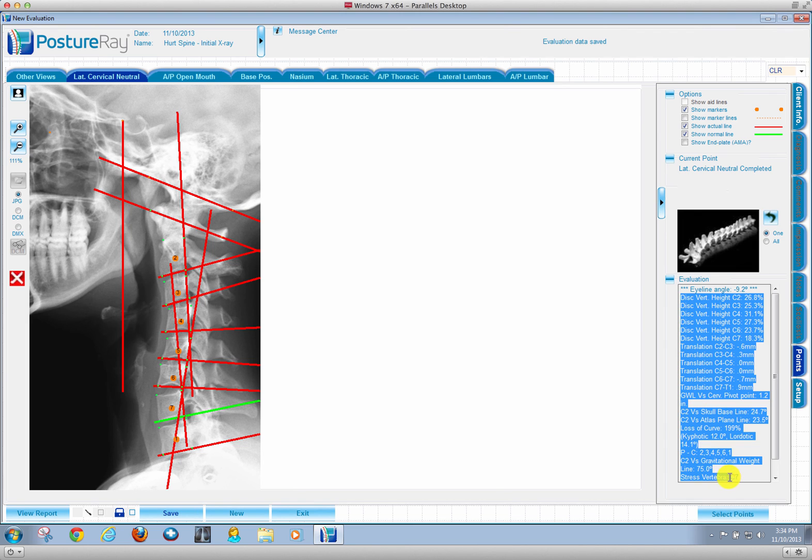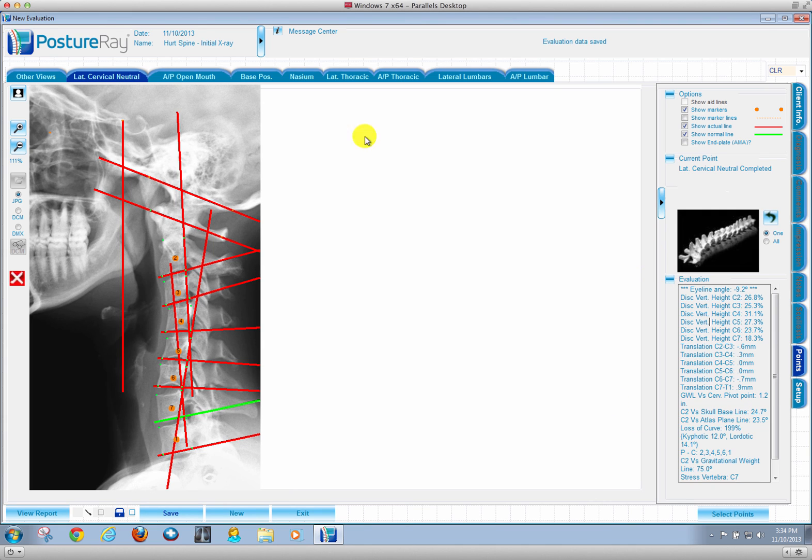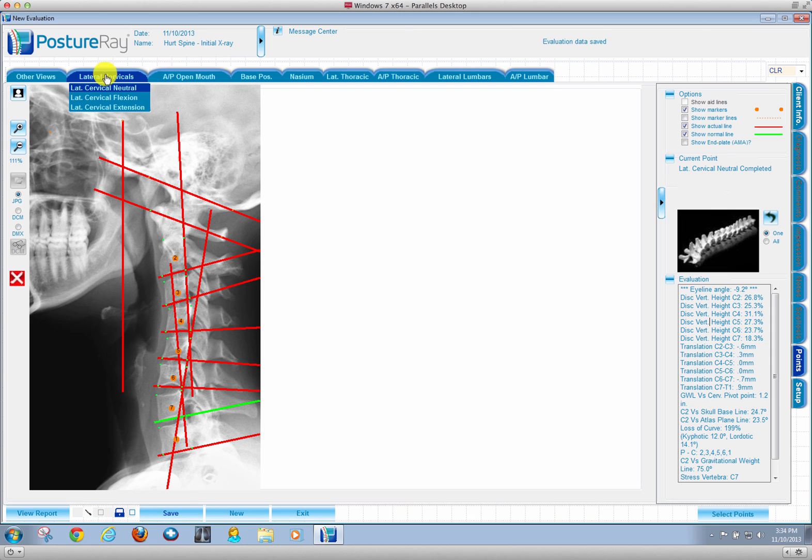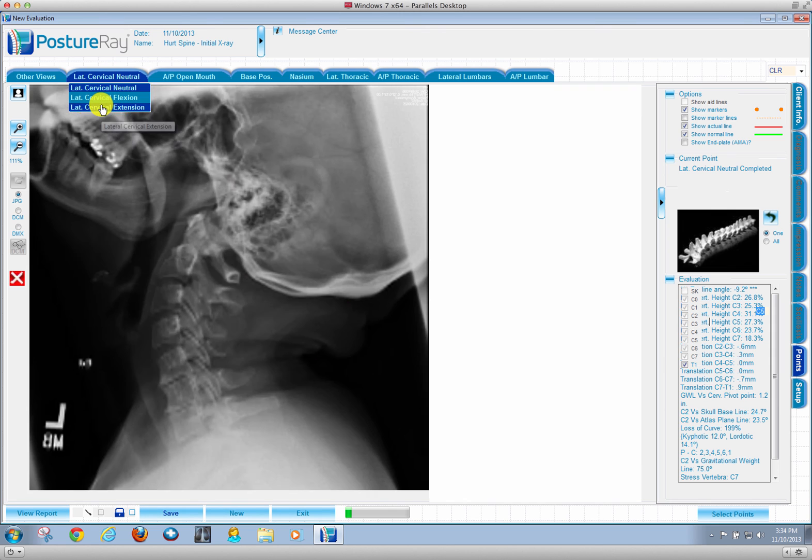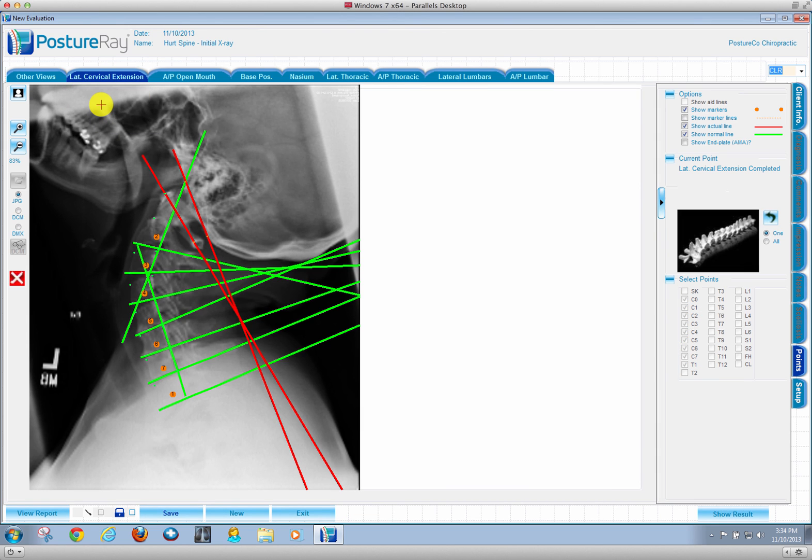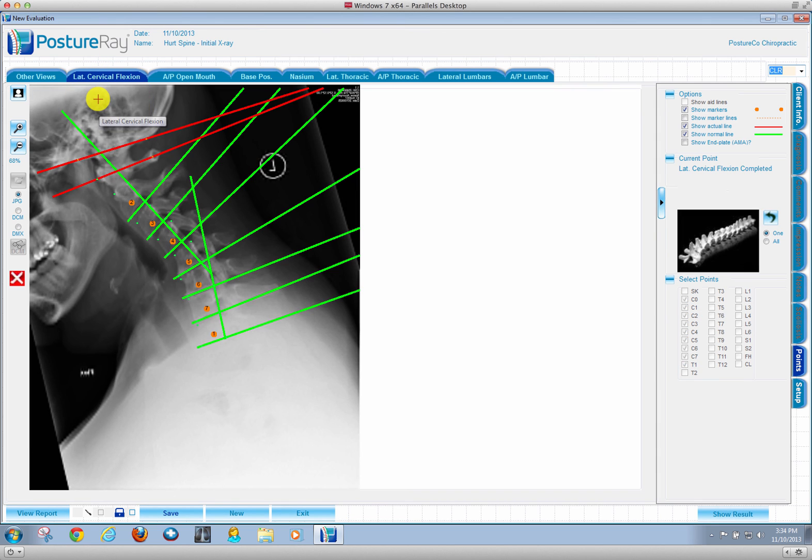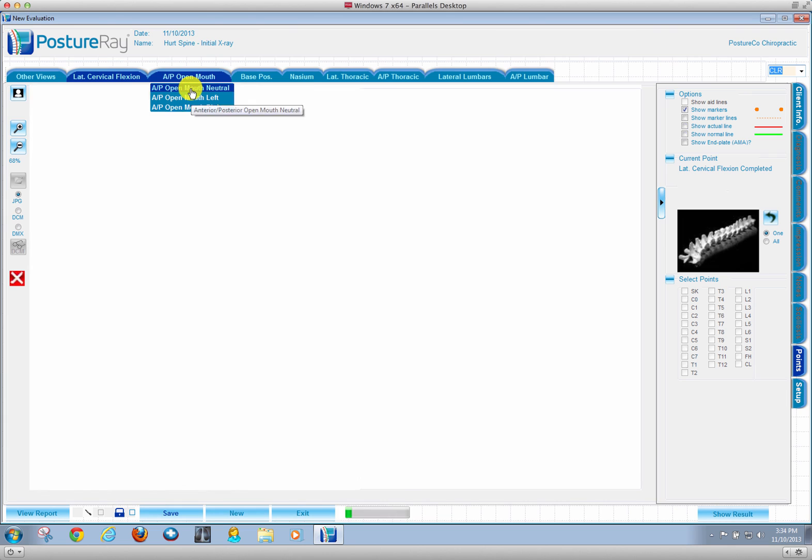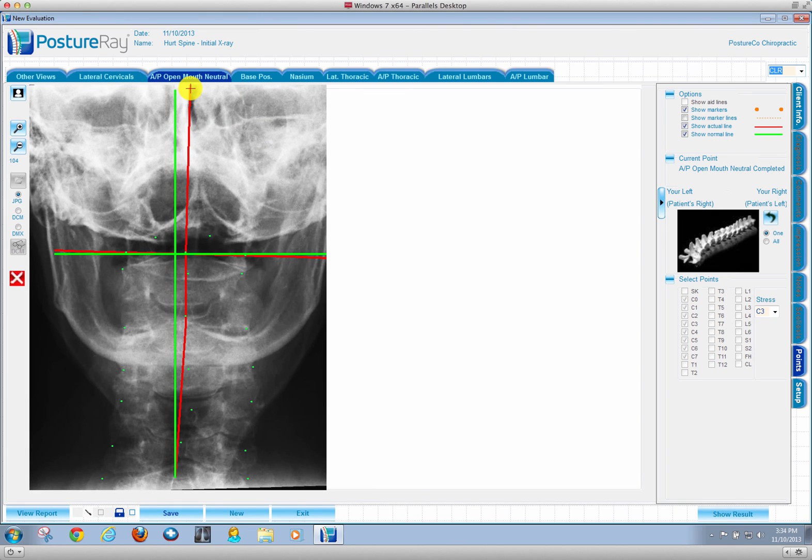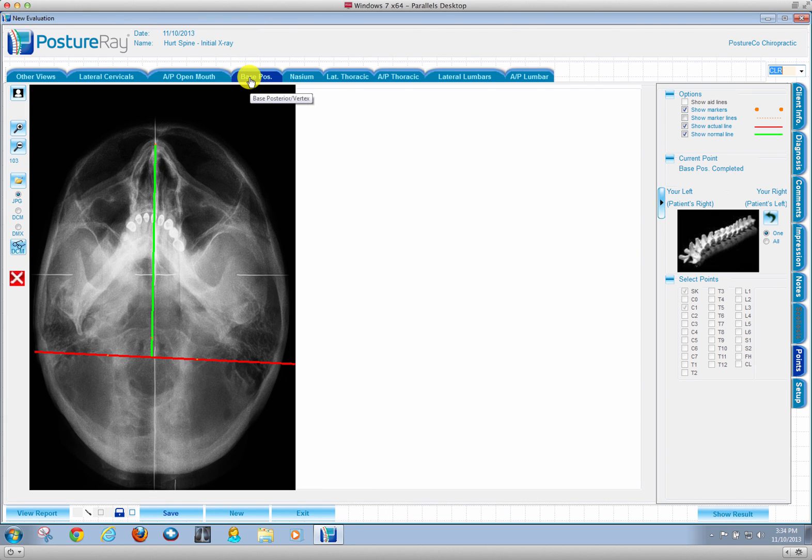All you need to do is be able to digitize. Let me show you, we have the ability to do flexion extension views as well, the AP open mouth via Clear as well as base posterior.